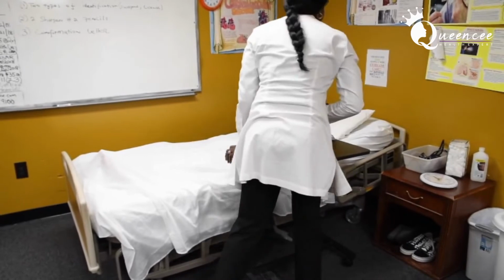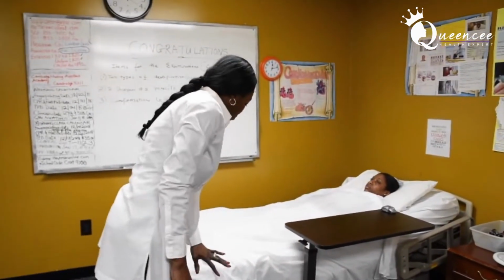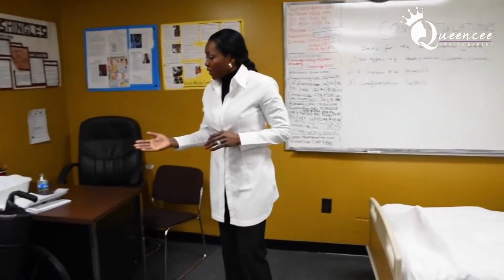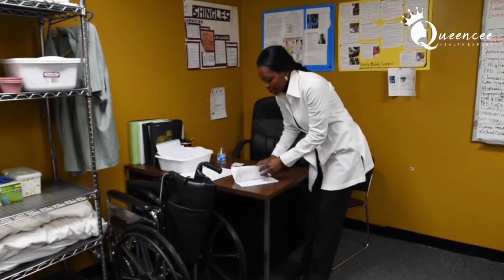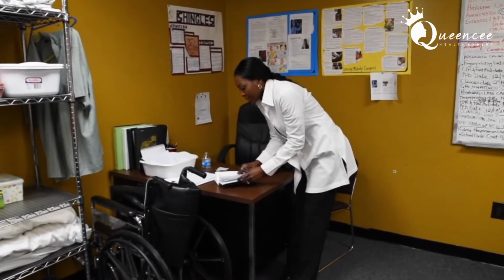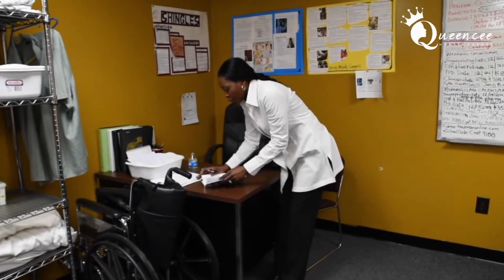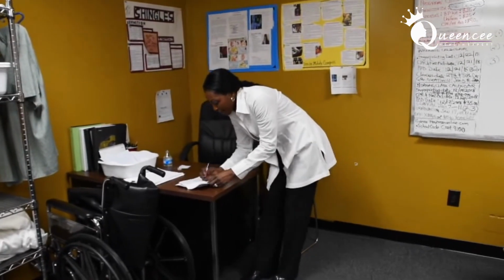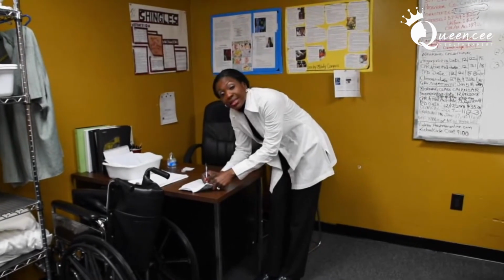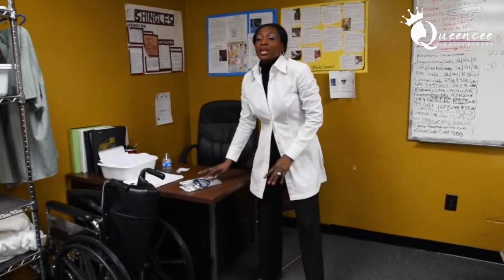Call light is within reach. My bed is in the lowest position, and I'm going to wash my hands. Then I go to my recording sheet, and where it says blood pressure, once again I would record. I got 90/60. Okay, no letters behind it. I just write it down and I give it to my patient.